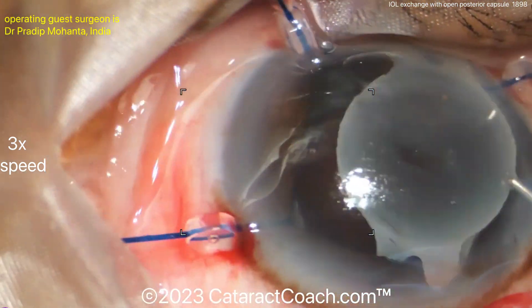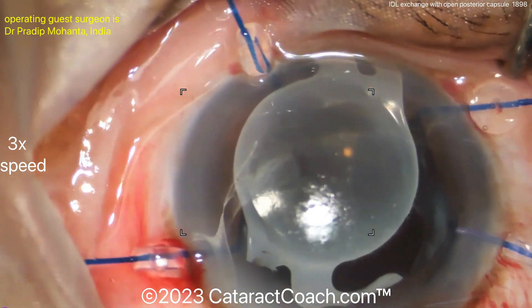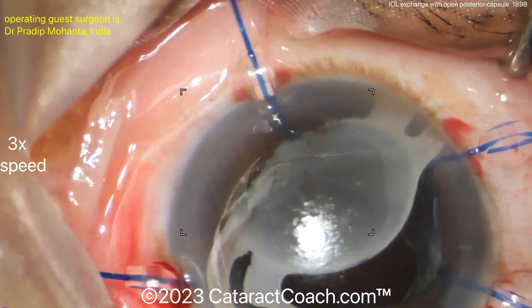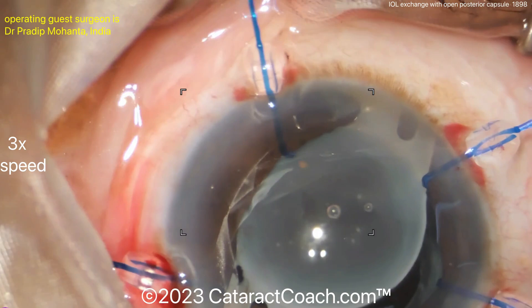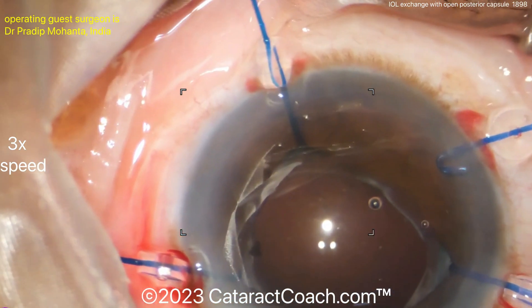When a lens becomes calcified it can be very difficult to fold or even cut inside the eye. In cases like this, you may have to enlarge the incision and take it out whole. This acrylic lens can become as hard as PMMA — polymethyl methacrylate — so taking it out in one piece is sometimes the right answer if you can't fold, twist, or cut it. And there it is — the lens is out.